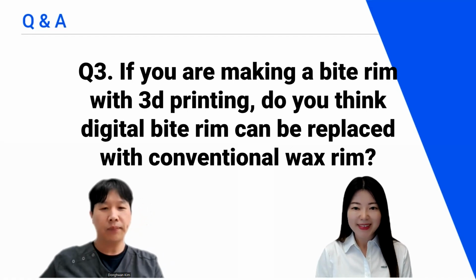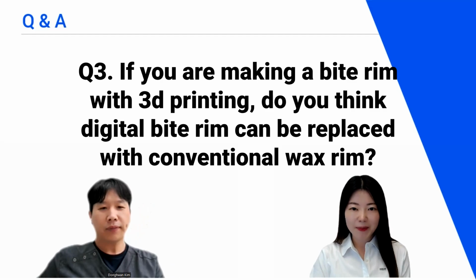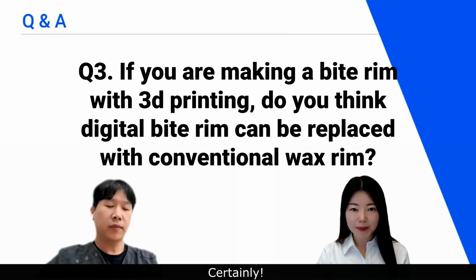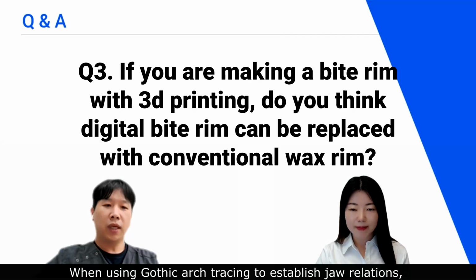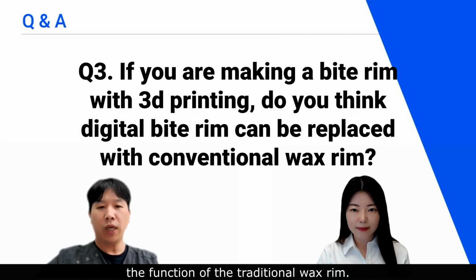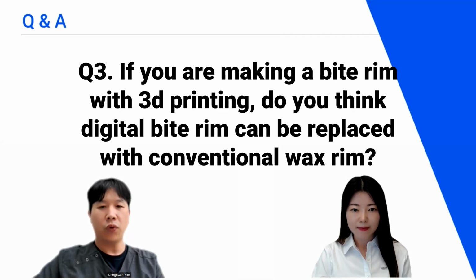Yeah. Okay, question number 3. If you're making a bite rim with 3D printing, do you think a digital bite rim can be replaced with a conventional wax rim? Certainly, when using a gnathometer to establish jaw relations, individual trays that incorporate this feature have effectively replaced the function of the traditional wax rim.